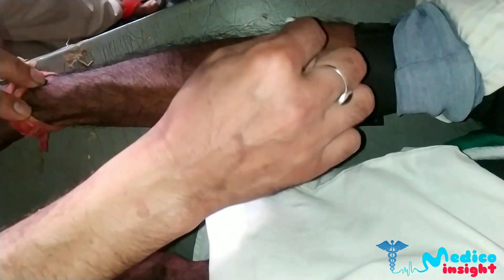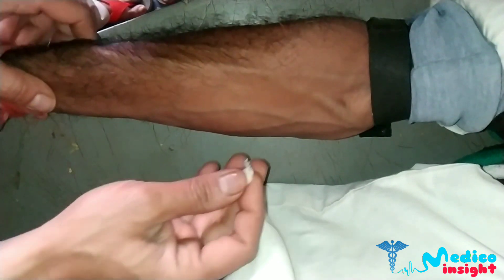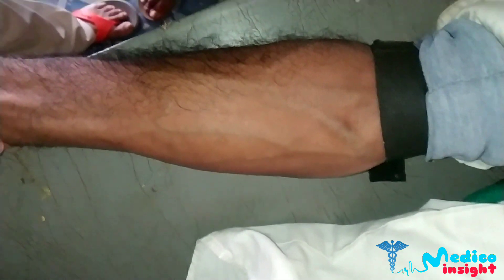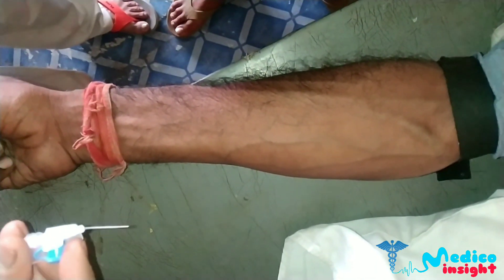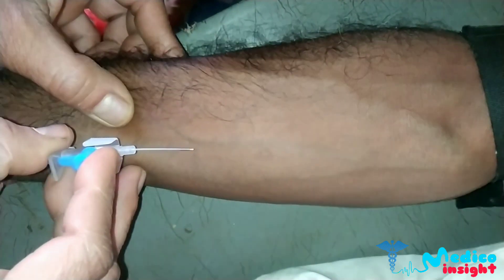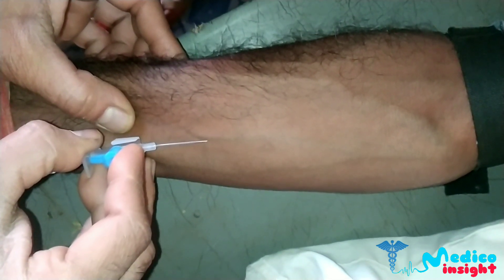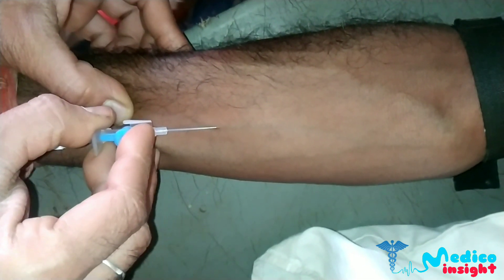Clean the patient's skin properly with the alcohol wipes. Remove the cannula needle cover and ensure not to touch the needle. Then stretch the skin distally and insert the needle bevel up at about 30 degrees, advancing the needle.